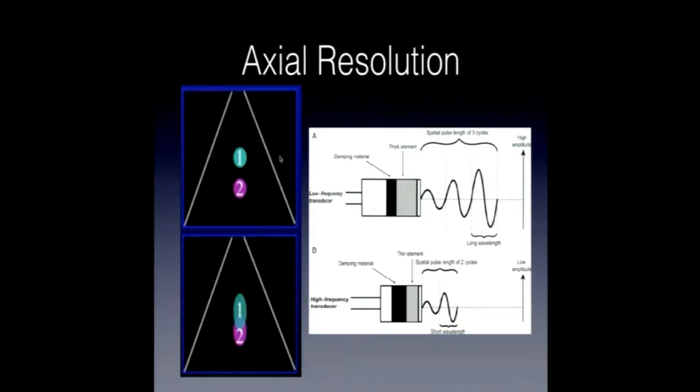and this is an interesting aside on transducers as well. On the right pane, there's two different transducers, and you can see the element of the transducer, and you see it's thin here and thick here. And what happens is it rings back and forth, and some of the energy is at the end of the transducer, and that will affect the wavelength. The design of this element affects the wavelength that the transducer makes.